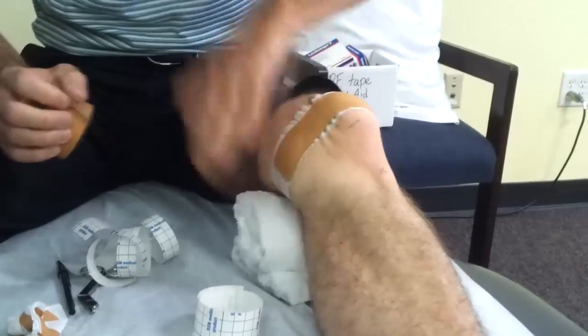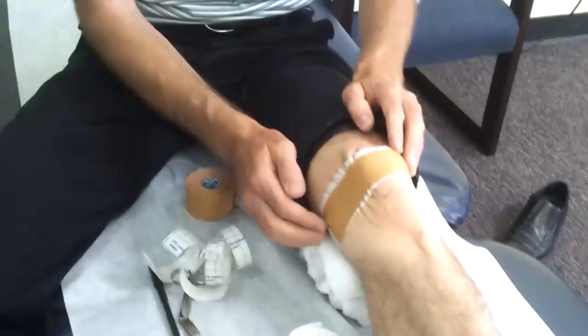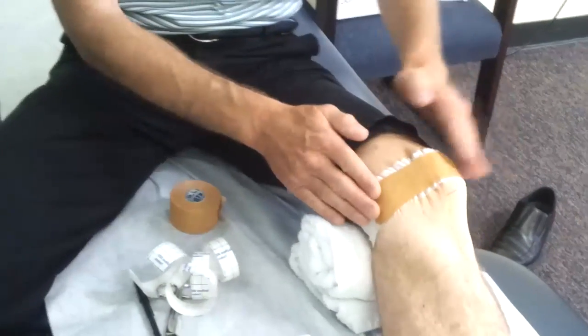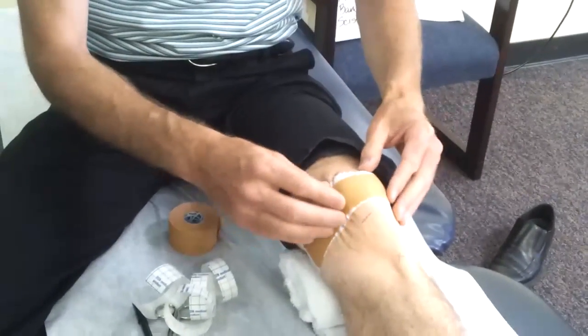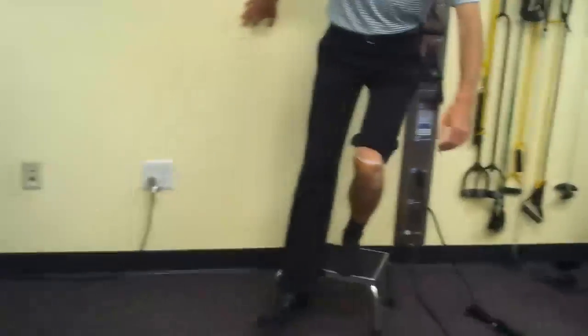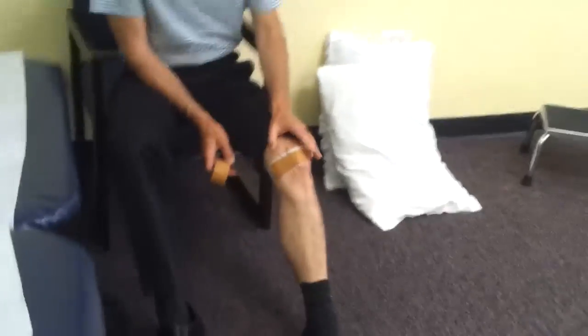Ideally you determine what's enough for you — we don't know how many strips you need to feel better, just like we don't know how many Advil you need. Do you need one strip of each? Maybe you just need the tilting, maybe you need the gliding. If you're trying to figure out what makes running or going downstairs hurt less, try one of them and test it. If you feel a little better, maybe adding more tape helps. You use trial and error to figure out what combination of medial glide and medial tilt works best for your knee.